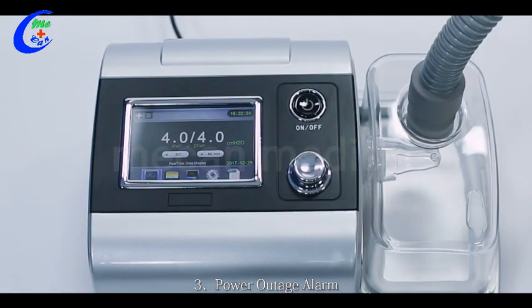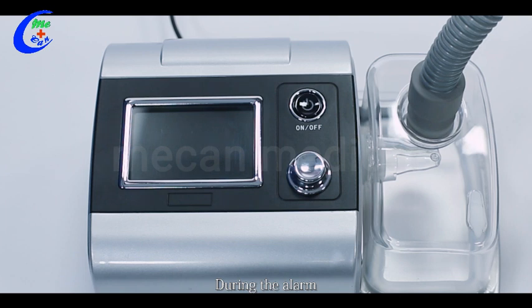Three, power outage alarm. When the device powers off in working state, it will give a buzzing alarm lasting for about 30 seconds. During the alarm, press the on/off button or connect the power supply again — the alarm will stop and it will return to normal working status.